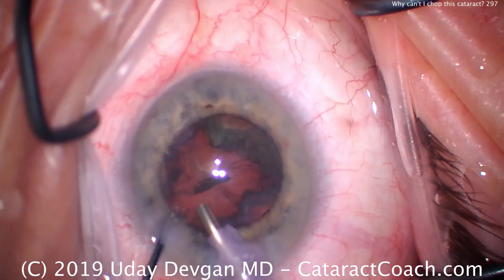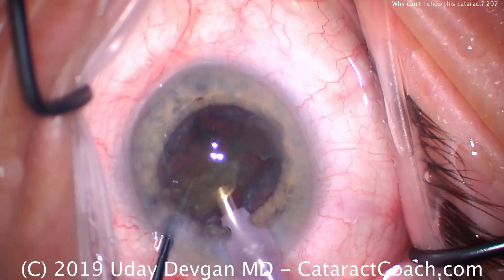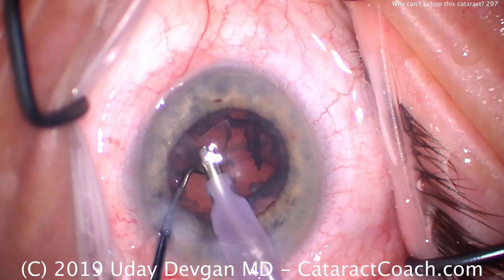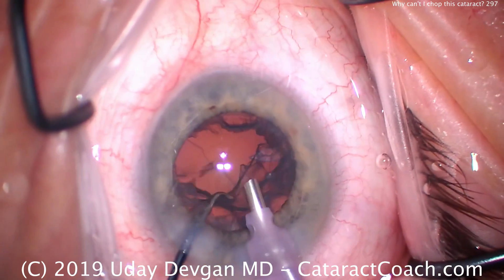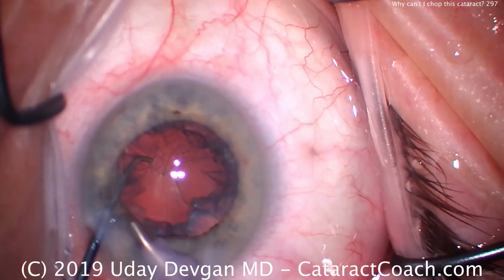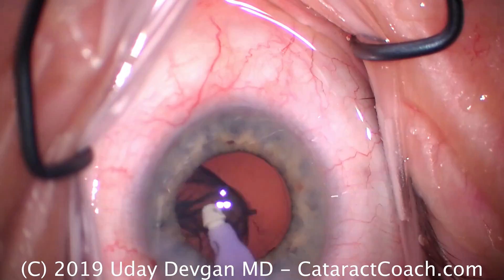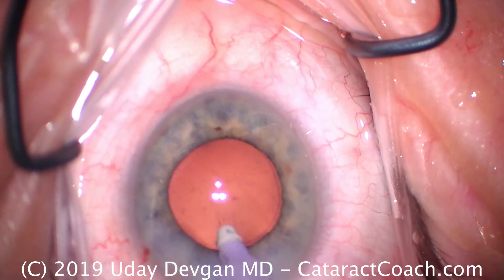I'm seeing it now in the video. At the time of surgery I didn't figure this out just yet. We'll bring this last piece — there we go, last bit of the cataract coming out. Looks pretty reasonable, and I think we're almost ready for that epinuclear shell. There it is, take that down. I'll just do it with the IA probe. Finally we can make the switch. There's the end of the cortex removal — everything's totally normal now. Seems fine, but I still don't know why I couldn't chop that cataract.